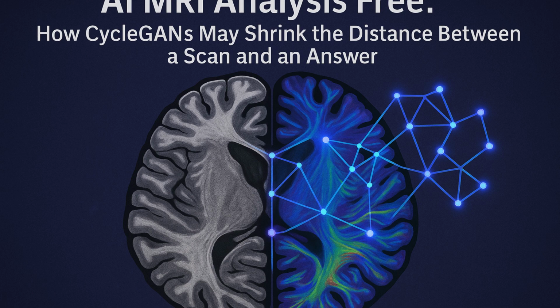Right. That preprint you mentioned, Dew and colleagues, it gives a really interesting angle on this. Yes, the CycleGAN paper. Okay, let's get into this research. It's pretty intriguing stuff. So this preprint talks about creating fractional anisotropy maps, FA maps, directly from standard T1-weighted MRI scans using something called 3D CycleGANs. Now, if you listening have had an MRI, you might not know FA maps, but they actually show really crucial stuff about your brain. That's right. FA maps are essential. They reveal details about the brain's white matter microstructure. A wiring. Kind of, yeah. Think of it as the intricate wiring connecting different brain parts. Super important for understanding connectivity, spotting tumor boundaries, and just general neuroscience research.